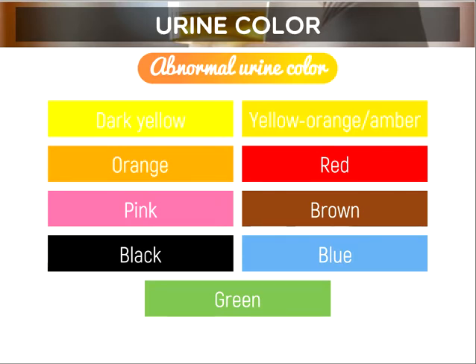Okay? Now we have the abnormal urine colors. It's very colorful. We will discuss them one by one later. But you have to take note that the color of the urine is greatly influenced by its concentration. It is directly proportional.